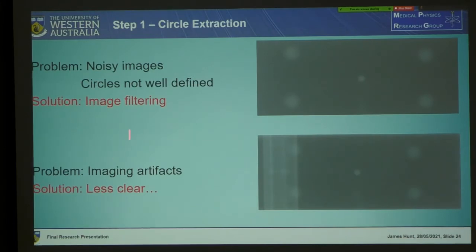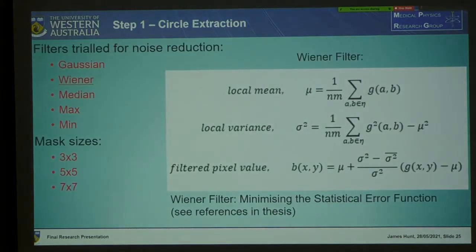So as I mentioned, noisy images, circles weren't well defined. I addressed that through image filtering. I tried a lot of different image filtering techniques. Imaging artifacts, there were less clear solutions. As I mentioned, I ultimately couldn't really resolve those in the scope of my work.